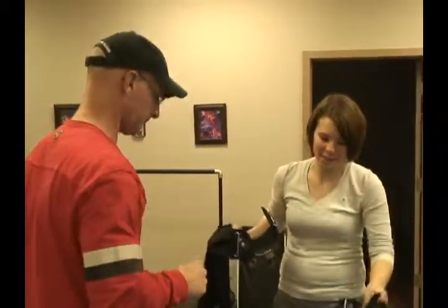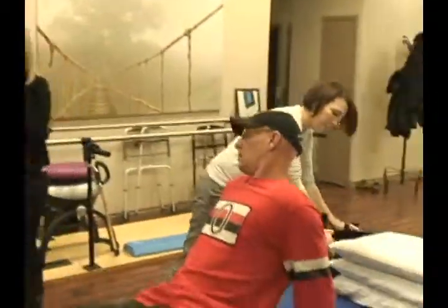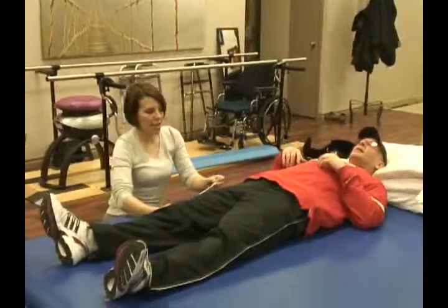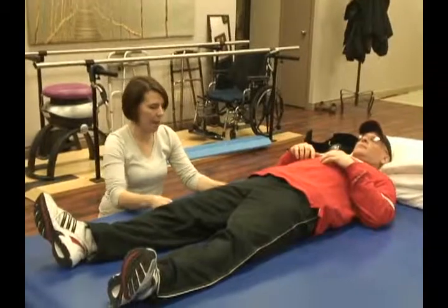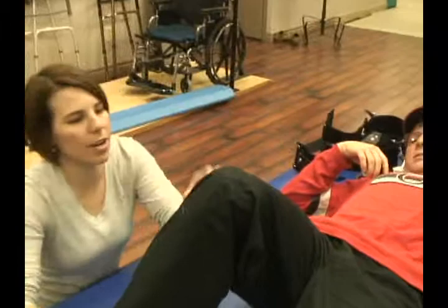Step one for the locomotor. I'll get you to lie down. So the first thing is measuring your leg length. First I do the femur, just landmarking here.